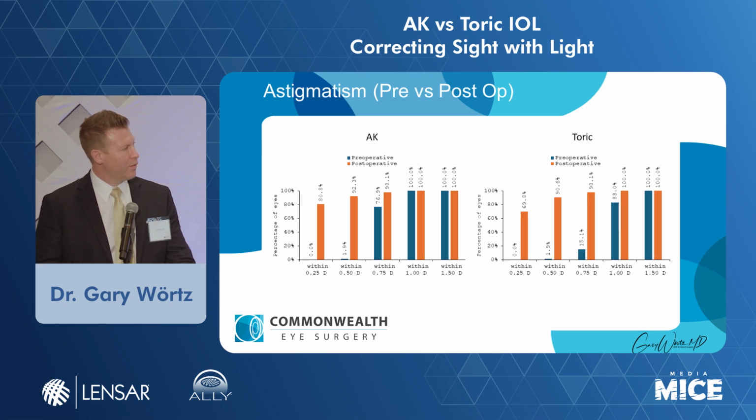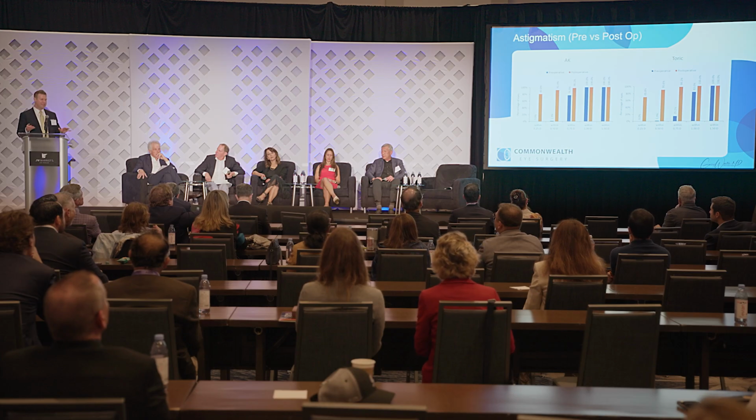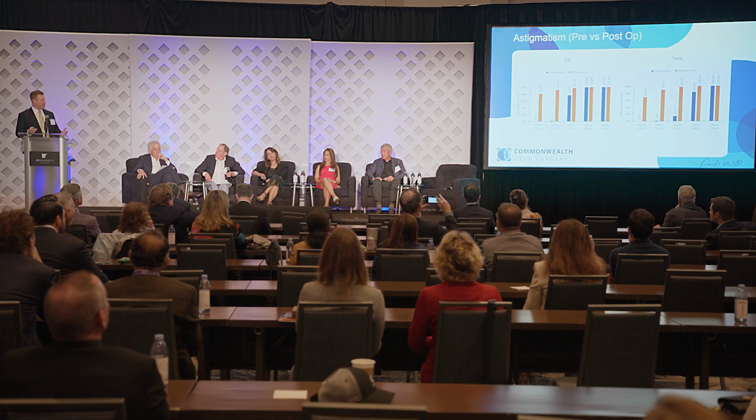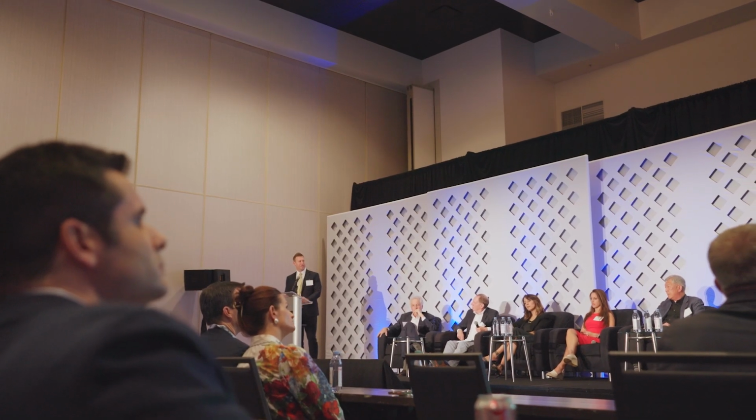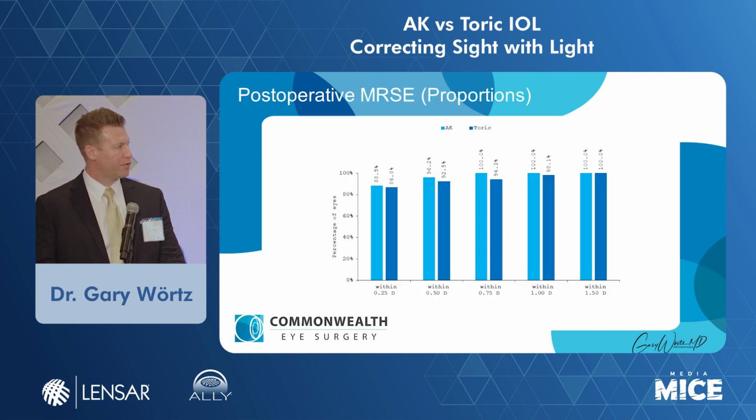If you look here also, we have about 92% of patients within a half diopter when you're looking at postoperative astigmatism with the AK and 90% with the low power toric. So again, no statistically significant difference, and actually really pretty incredibly good correction of astigmatism that's on par with Denise Visco's data, which is the best data I've seen. So I was very happy to be in good company there, Denise. We were actually kind of surprised that the data was so good. I was kind of expecting the toric to outperform the AKs, but we're showing equivalence really with both treatments.